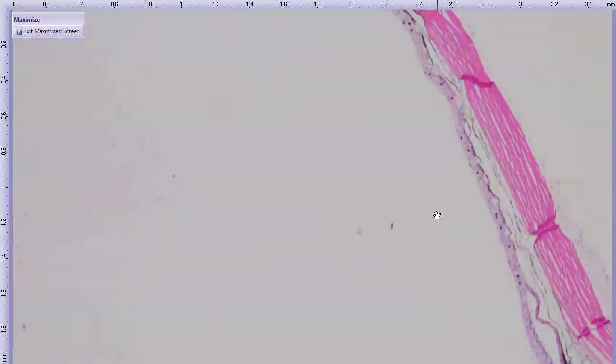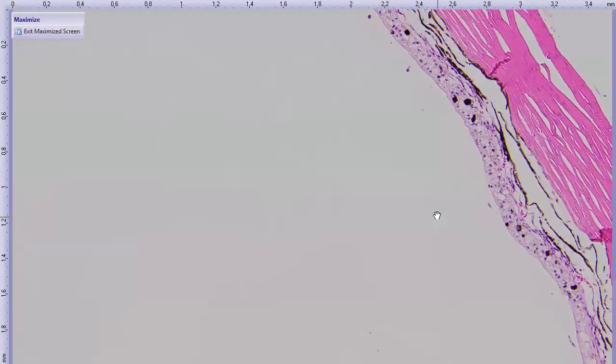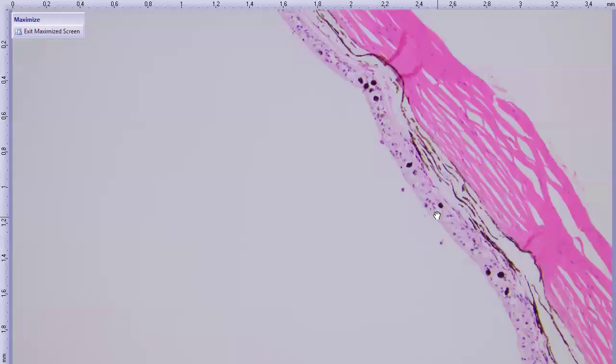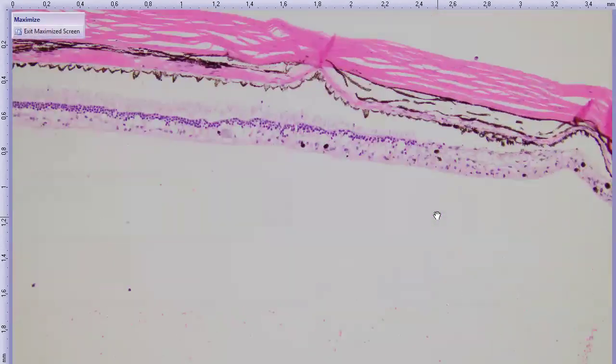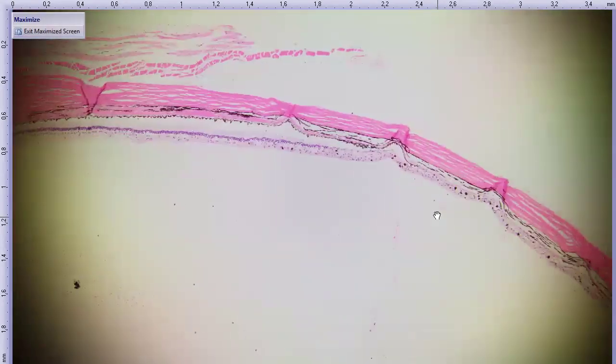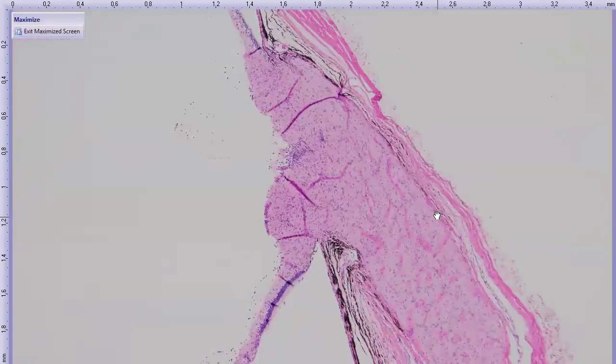And then, as we noticed from subgross, our retina here is quite atrophied, which is a little bit interesting, especially because it was segmental in nature. Even heading out peripherally, it starts to come back, which is a little bit odd. Usually the peripheral retina is more atrophied with aging, but this is a young rabbit. And then we have some nice gliosis in our optic nerve.